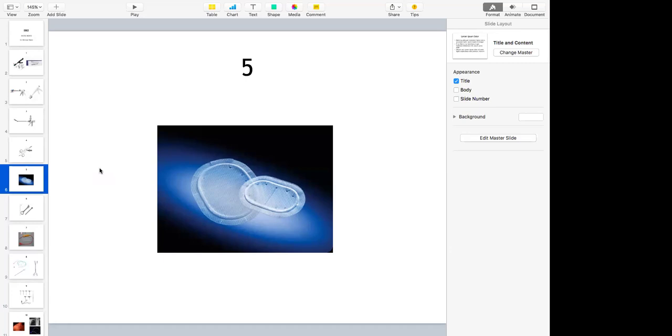This mesh is also used to cover the implant in post mastectomy or implant based breast reconstruction, where there is non-availability of acellular dermal matrix and you're putting in a prepectoral implant. You can use this titanized mesh.